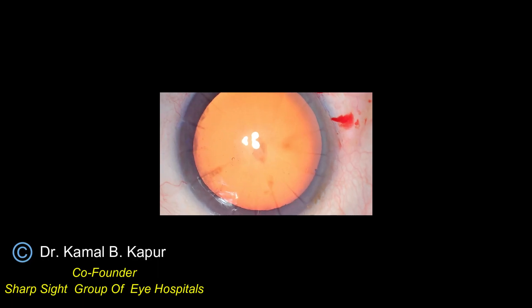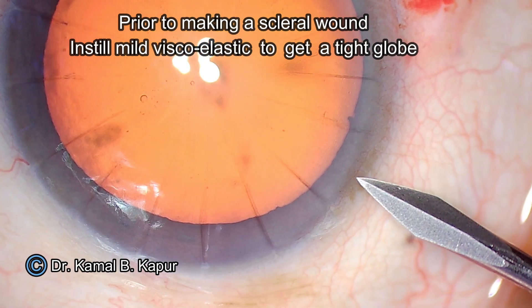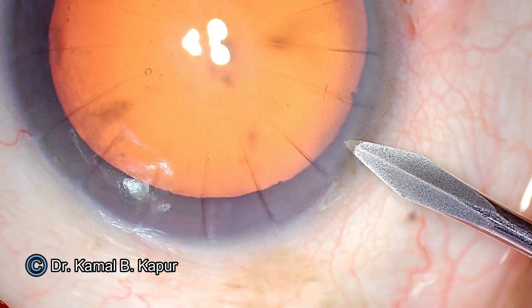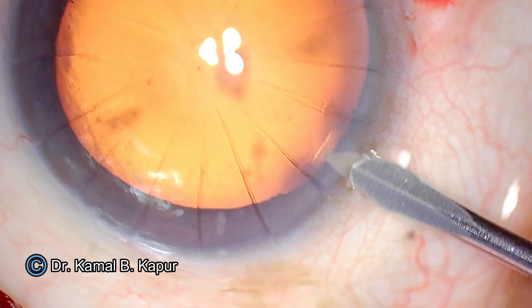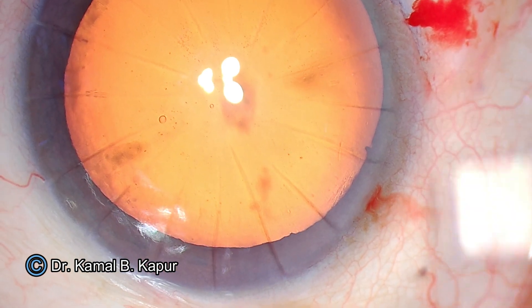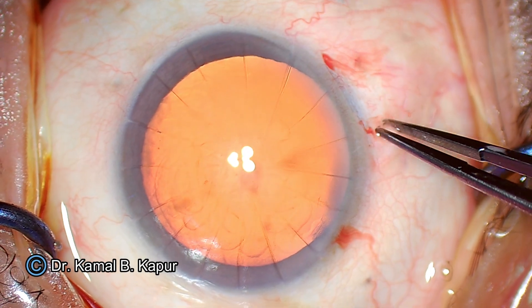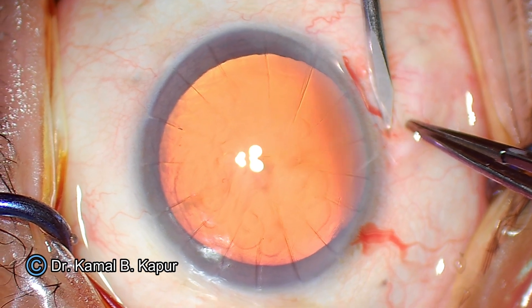You will see that I have done a meticulous cauterization. Now, find a space between any two cuts which gives you enough space of approximately 1.5 millimeters. Put your MVR blade right in the center, but be always very cautious not to have a complete entry — leave at least 500 microns to half a millimeter on either side of the sideport. Then instill a small amount of viscoelastic, remembering not to over-inflate the chamber because over-pressurization may cause the cuts to open.